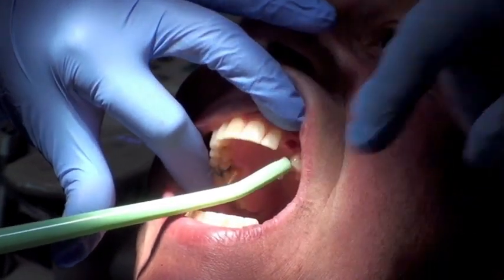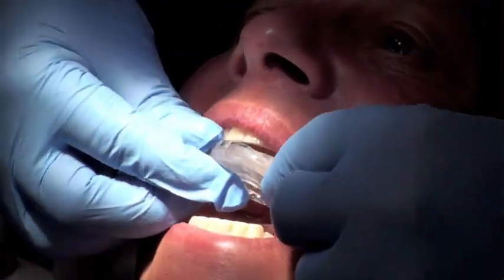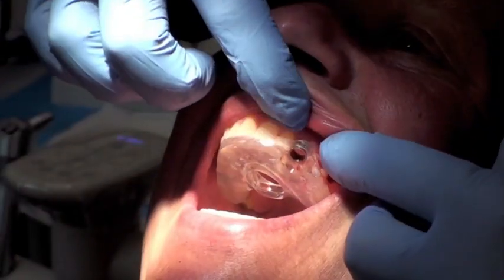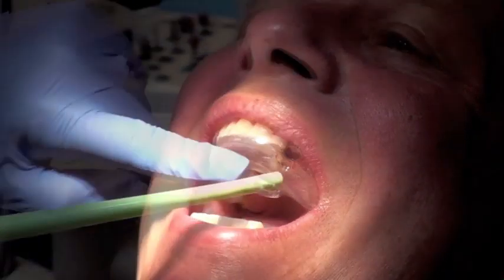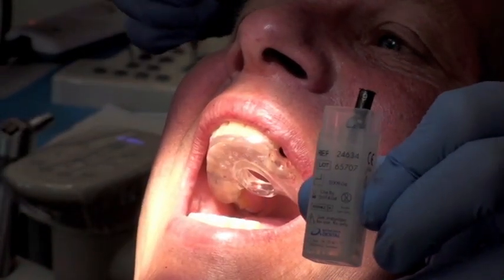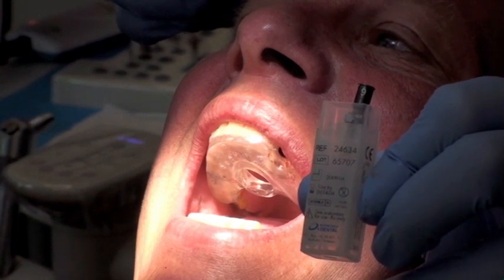Heavy irrigation to remove any tissue tags that may be placed or displaced at the base of the osteotomy. We're reseating the guide in this case so that we can actually place the implant through the guide. The master sleeve that you see in the guide allows us to truly have guided implant placement.